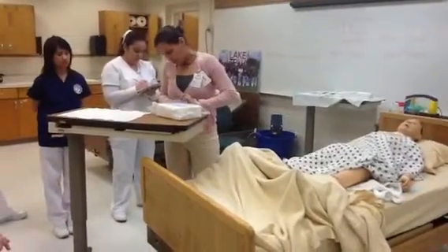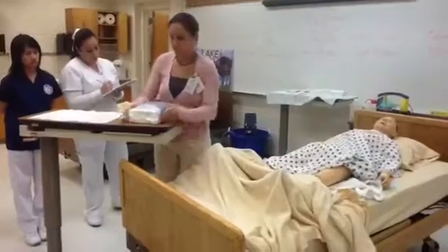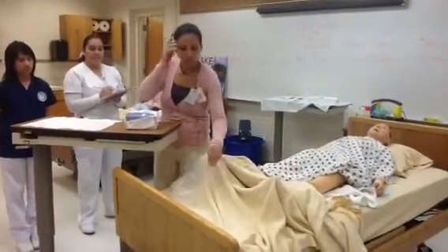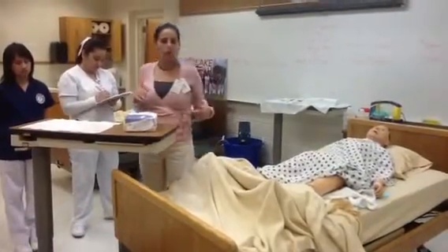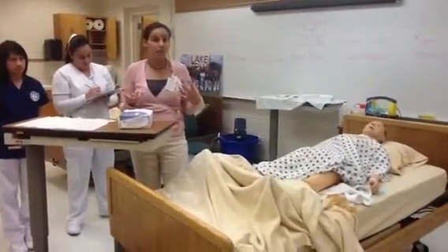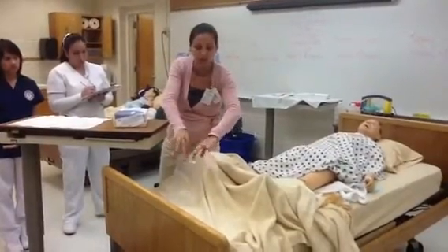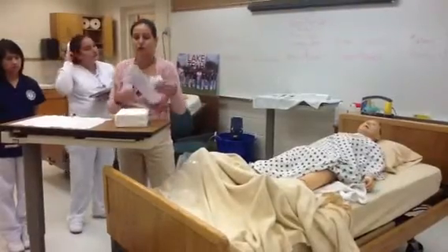And then all these packages have a little perforated end. You just have to figure out which end it is. We can use the packaging for a trash area. You need to be very careful, though, that you do not contaminate your sterile gloves on this by trying to drop things into it. You need to make sure that it's open very wide and that you're just dropping into it if you choose to use that.